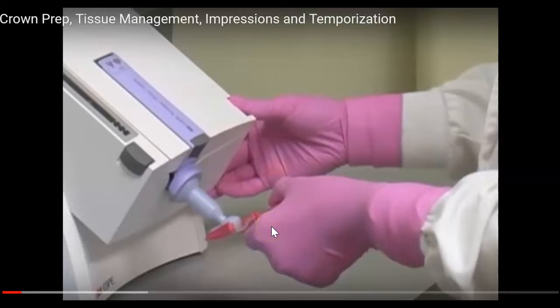A triple tray can be used, it has a mesh in between, and what's nice about this triple tray, as you'll find out here in a minute, is it's going to take the impression of both the upper and lower teeth at the same time. So that can be sent off to the lab, and then the crown or restoration be fabricated from there, but they're able to pour up both ends and also get the opposer on top of it.